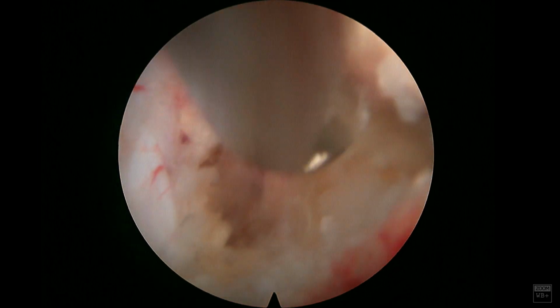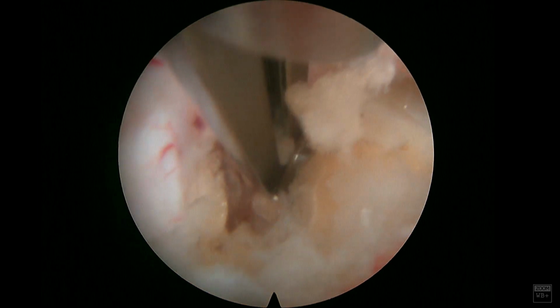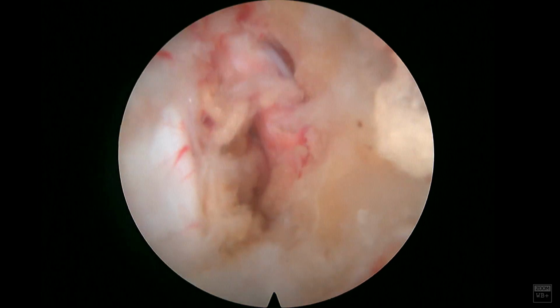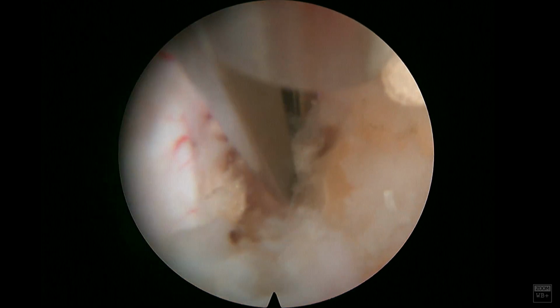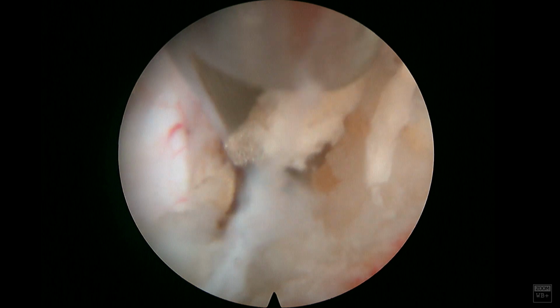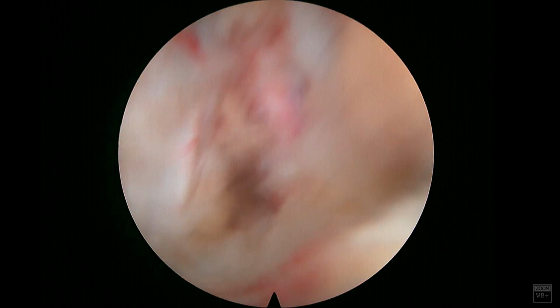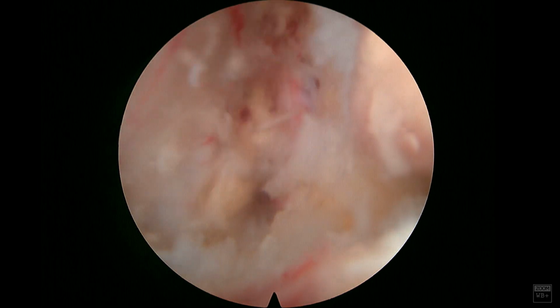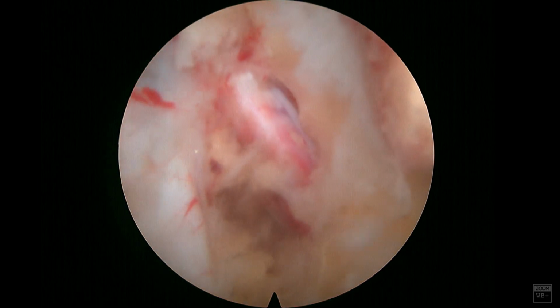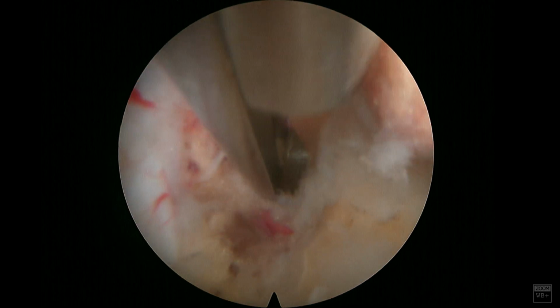And so this is a really great example of ultra minimally invasive decompression. Could I have done a fusion and a 360 at the L5-S1? Potentially, but I was worried about that hypertrophic facet and the impingement on the traversing L5 nerve root. So my fear was that if we went with the 360 first, we would potentially still have radiculopathy due to the hypertrophic facet cyst.